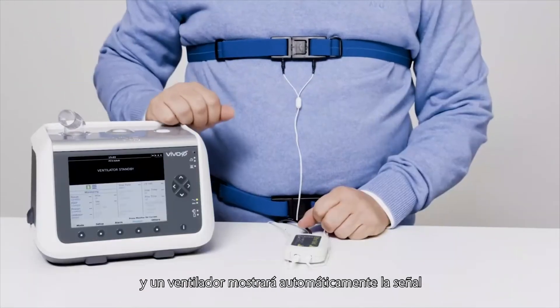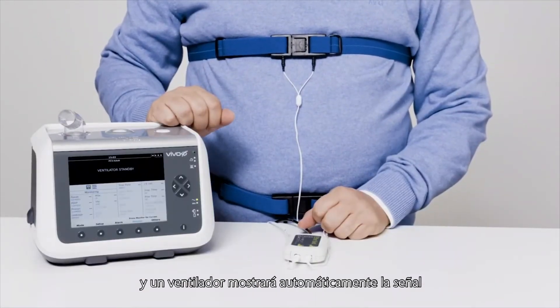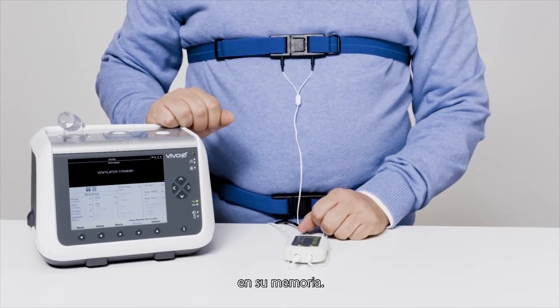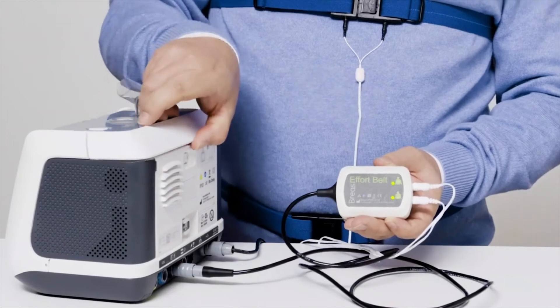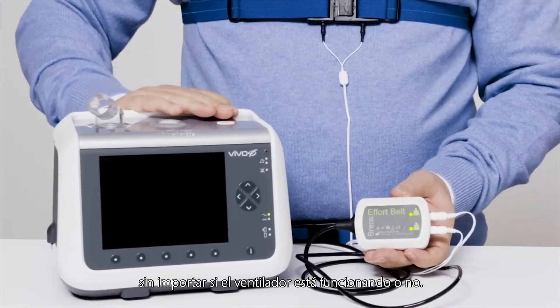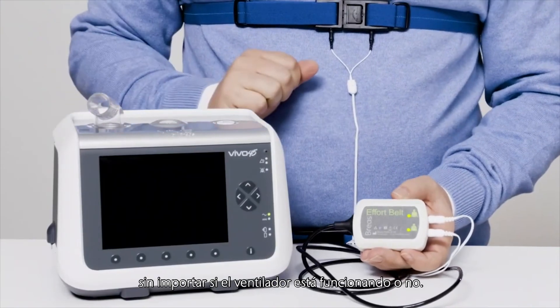The ventilator will automatically display the signal on the monitor screen and record and store the signal in its memory. The effort belts can be connected or disconnected regardless of whether the ventilator is running or not.